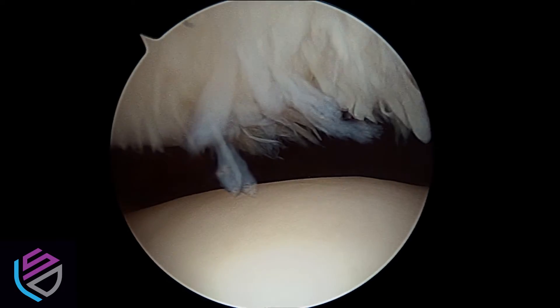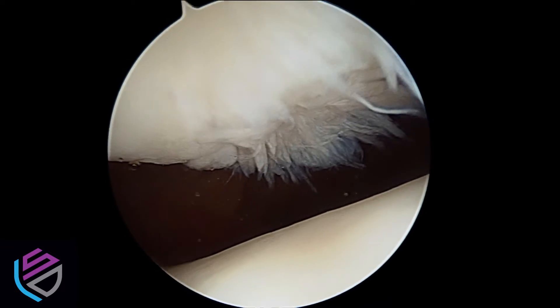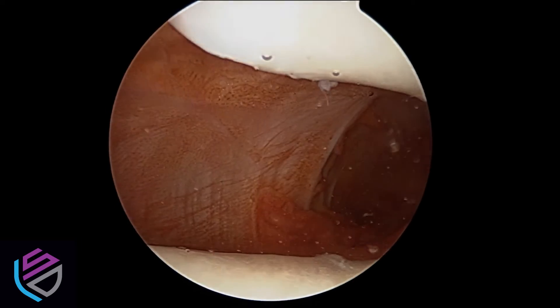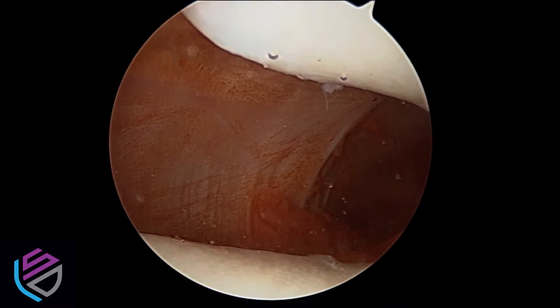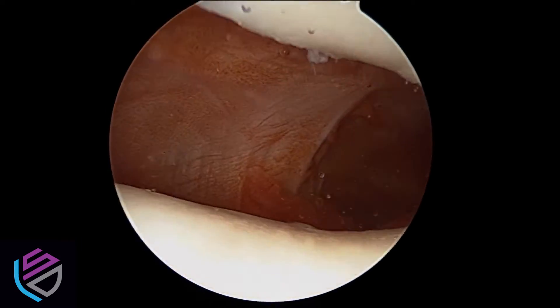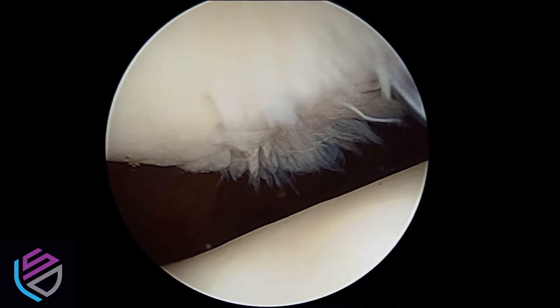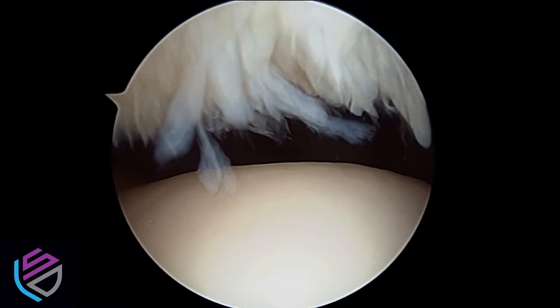On this arthroscopic video, you can see damage to the cartilage on the outer side of the kneecap or patella. On the medial side of the kneecap, the cartilage is nice and smooth and looks pretty normal. And as we move back to the outer side or lateral side of the patella, you can see some pretty significant damage to the cartilage.